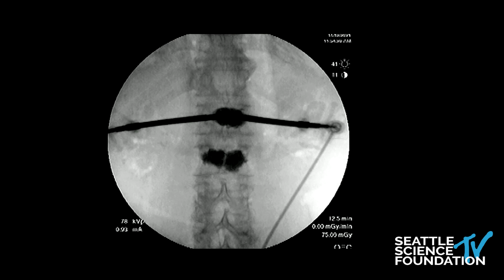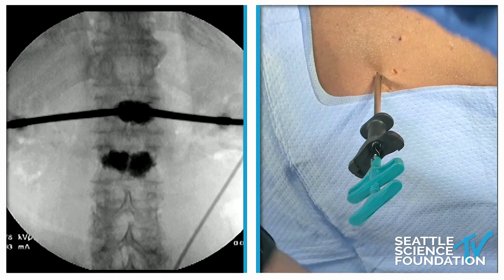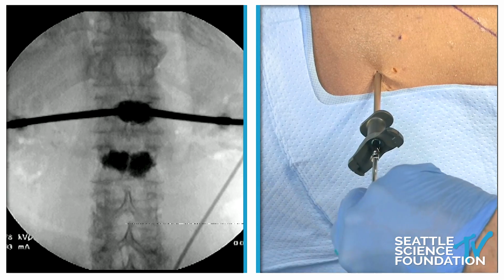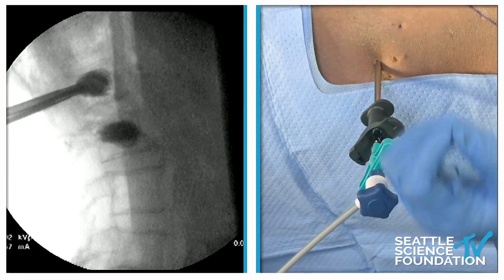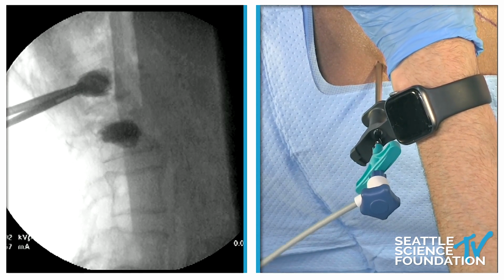So at this point in time, we're going to switch out. Let's go ahead and go back to lateral. As Dr. Schonard says, we always inject cement on the lateral. And you can see it's right under the implant. Both the superior portion of those skis are right under that superior end plate. And there's about 1,500 newtons of lifting force with the combination of those two jacks. All right. And as the cement hardens, it controls the spine jack devices so they do not rotate and they remain ideally positioned and solid.